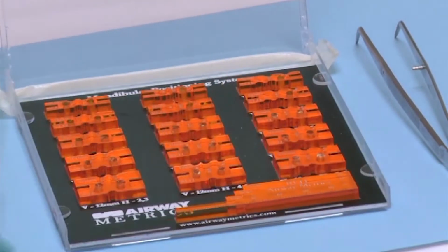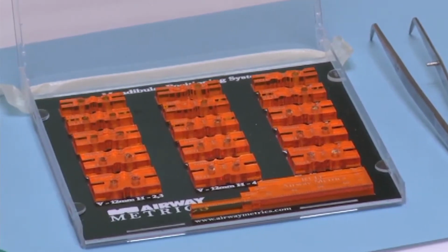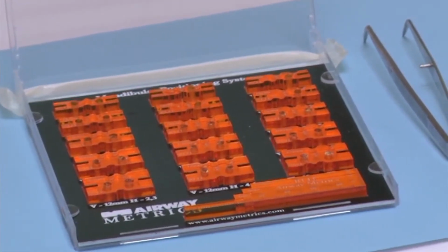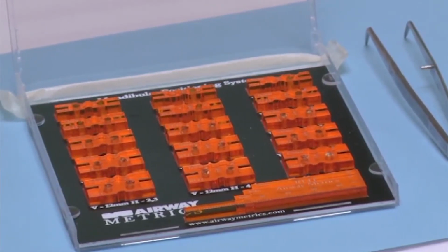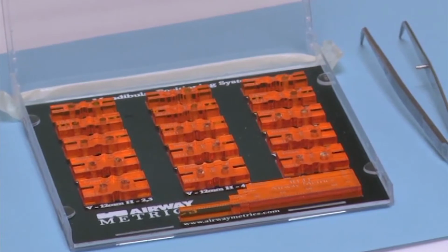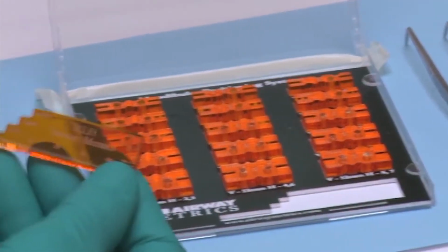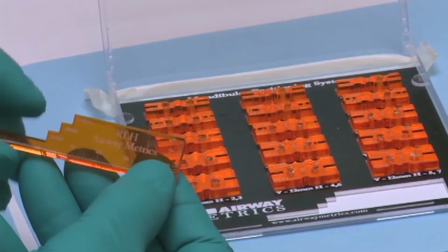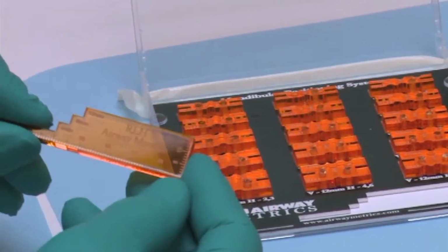So this is the Airway Metric system that we'll be using to register Kim's bite registration. This has a vertical component as well as a horizontal component. We're going to start first with what's called the snore screener, and this is to determine if there's a vertical component.